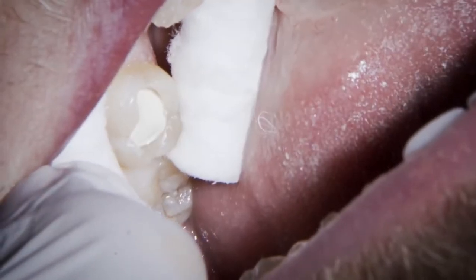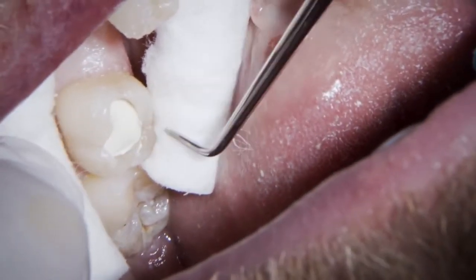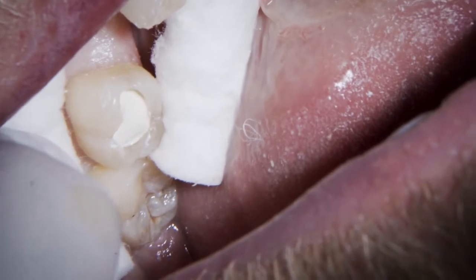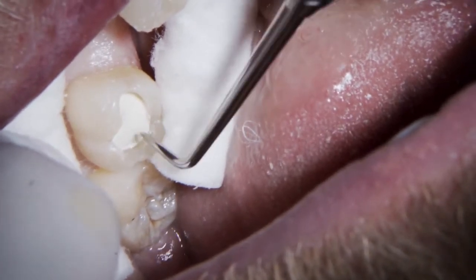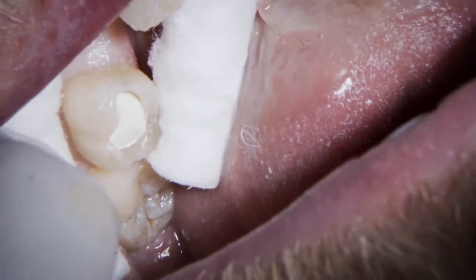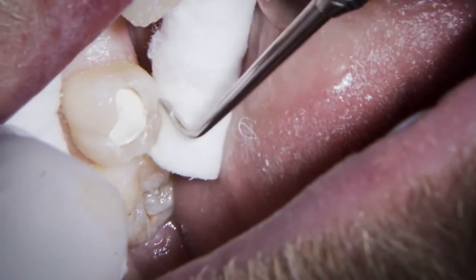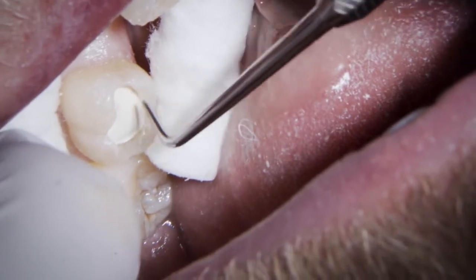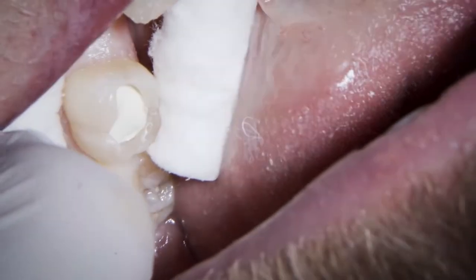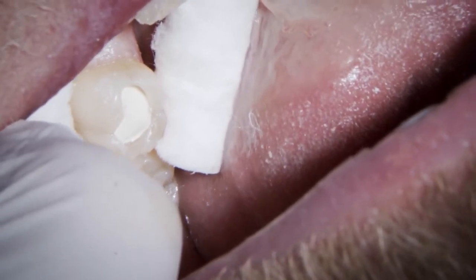That is just about perfect. You're also trying to think about the height you're creating. As I'm placing this I'm thinking about what the dentine morphology would be like — probably once it's set we'll take a little bit off the occlusal surface to make it slightly more concave, following the fissure morphology. But that's really nice — we've got good positioning up against the walls and we'll get a really excellent bond all around the outside with the edge.